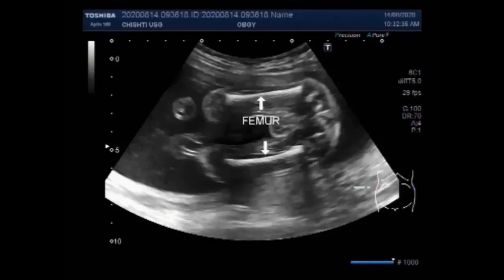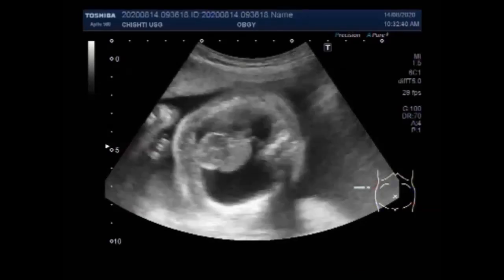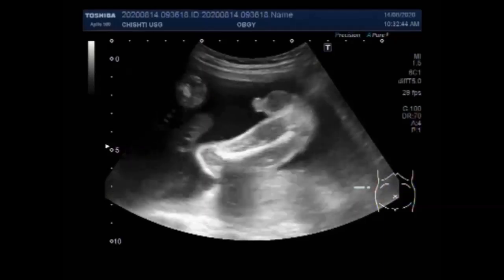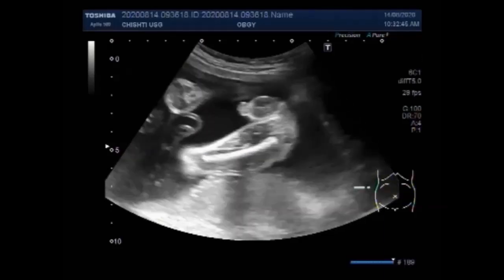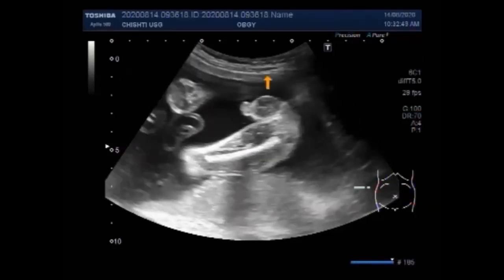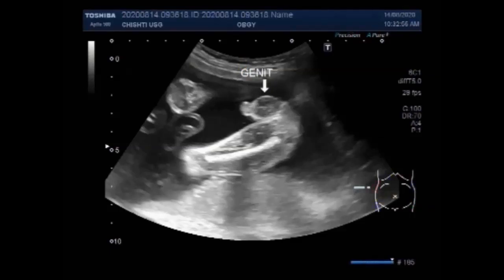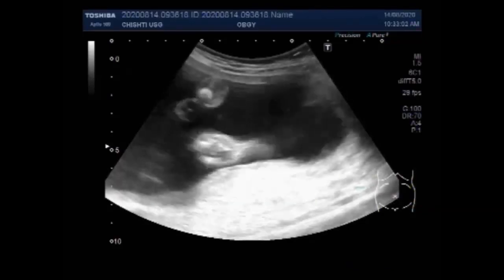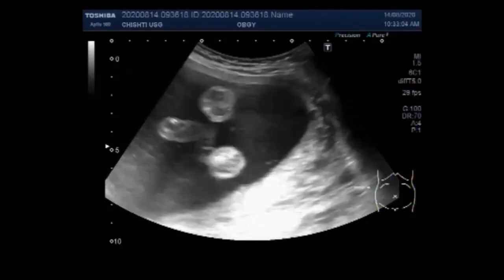Serial ultrasound examinations should be performed every one to two weeks for eight to twelve weeks after exposure. The most obvious ultrasound manifestation of fetal anemia is hydrops. By the time ultrasound evidence of hydrops is present, the fetal hematocrit is likely to be less than 20%. Now again you can see the fetal lower limbs.